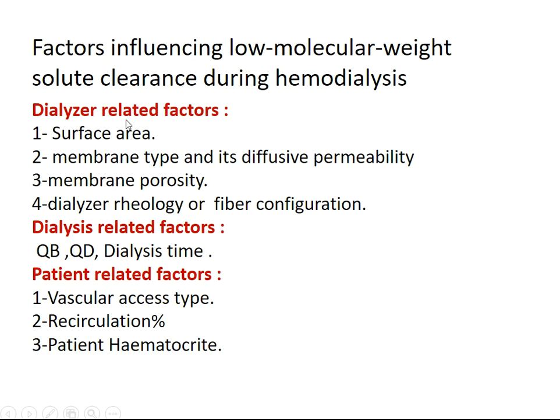For example, dialyzer surface area, membrane type and its diffusive permeability, membrane porosity, dialyzer rheology. In the dialysis station, Qb, Qd, and dialysis time. While in patient-related factors, vascular access, recirculation percent, and patient hematocrit.